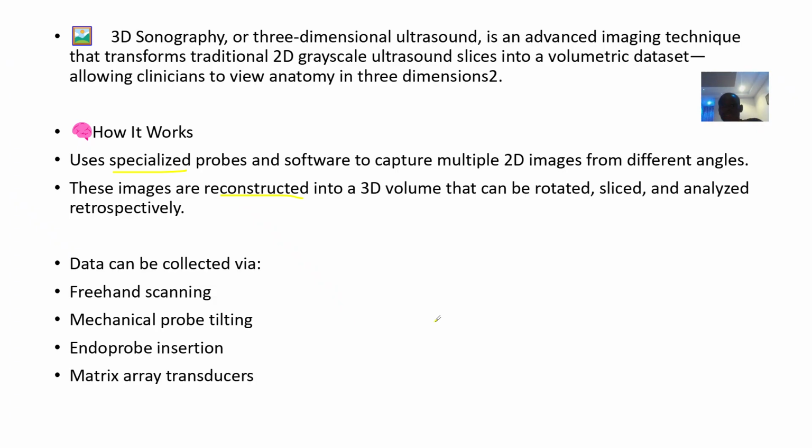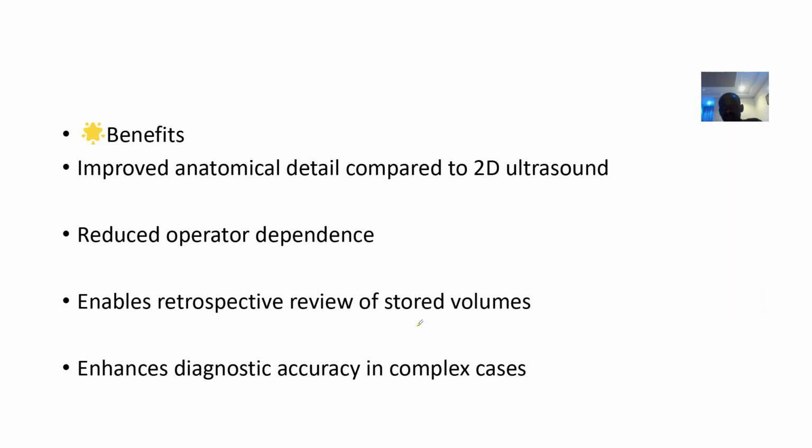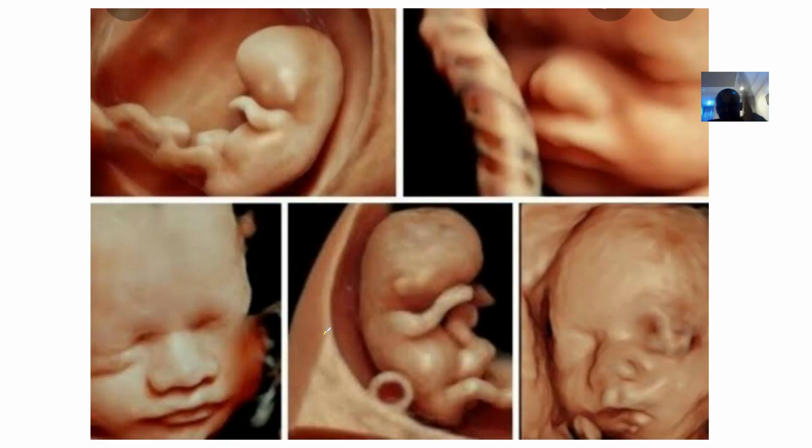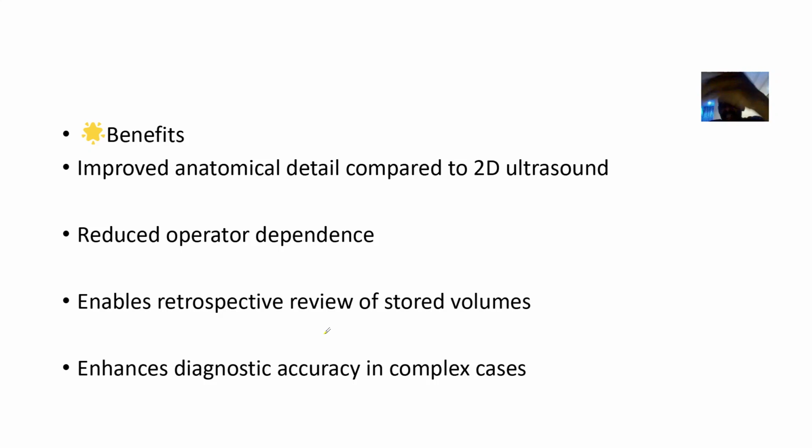The benefits of 3D over 2D: there's improved view, and there's reduced operator dependence. You don't really need specialized staff to interpret things for you. Of course, if I see this, I'm seeing a baby. Even the mother can follow along with what you are explaining.